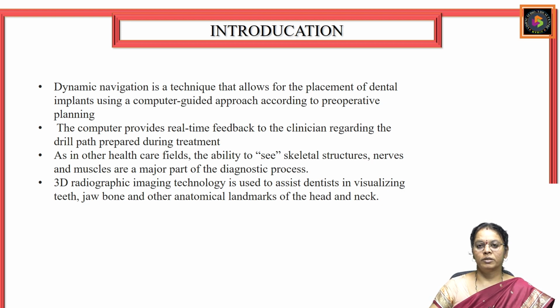In this methodology, it provides real-time feedback which enables the clinician to visualize the operating site dynamically, and whether the handpiece has reached the operation site or not can be directly visualized from the screen.